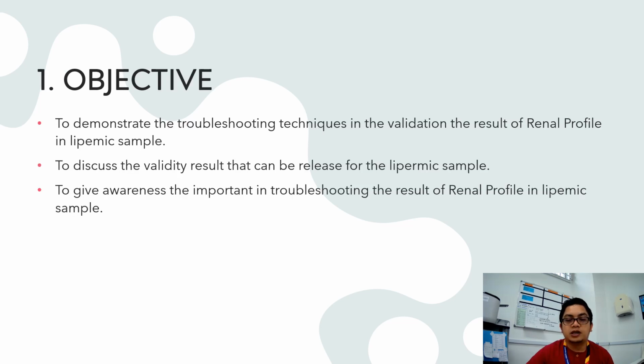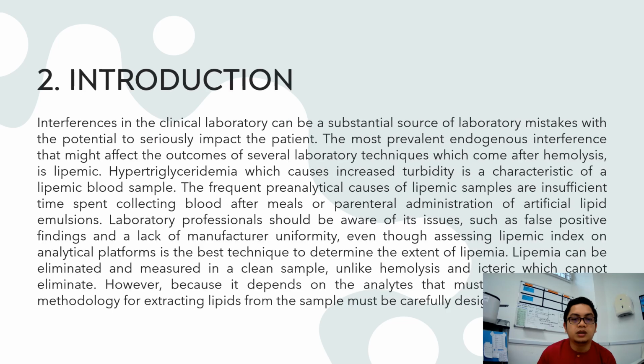The objective of this presentation is to demonstrate the troubleshooting technique in the validation of the result of renal profile in lipemic sample, to discuss the validity of the result that can be released for the lipemic sample, and lastly to give awareness of the importance in troubleshooting the result of renal profile in lipemic sample.